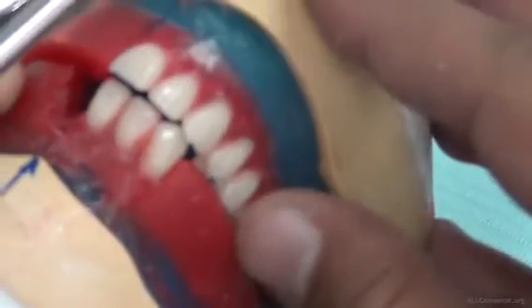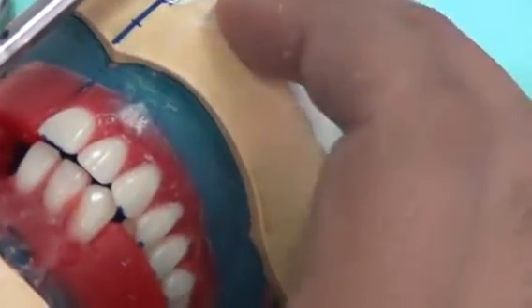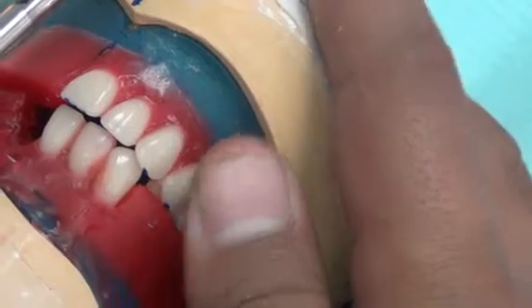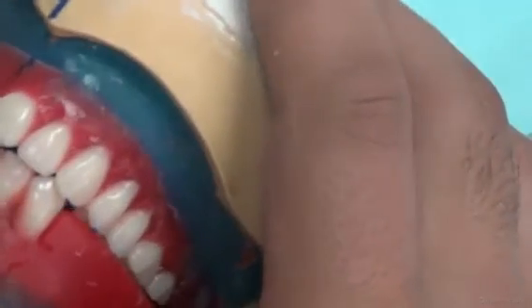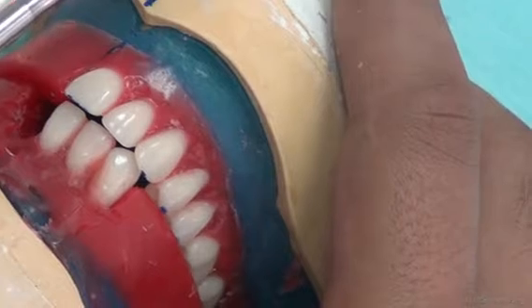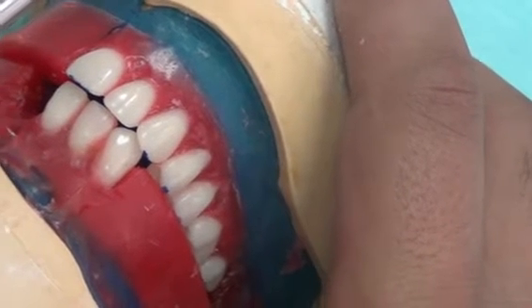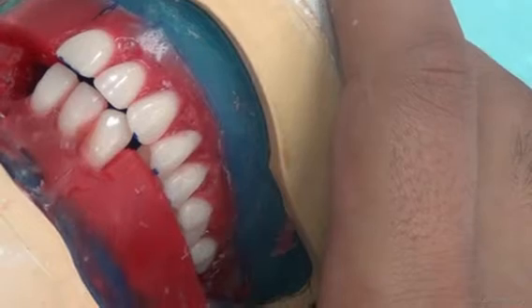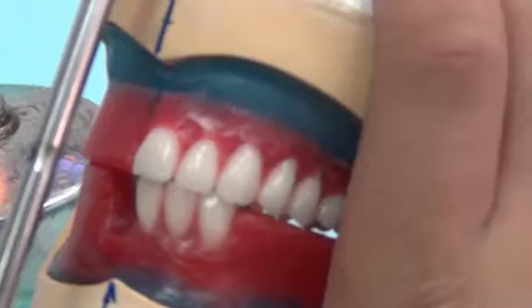So the width of the lower teeth is less than the upper teeth. The upper teeth are wider. So the position of the canine, to be correct, should be in the space mesial to the upper canine and distal to the lateral incisor. And this is the setting of the lower anterior teeth. And you may begin doing the other side as well for this level.